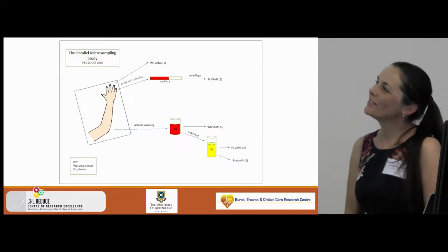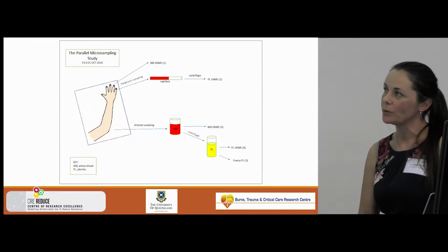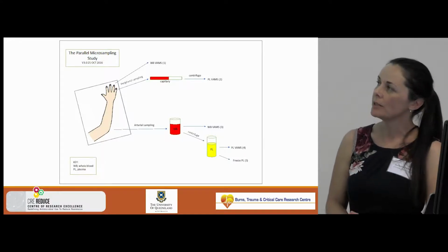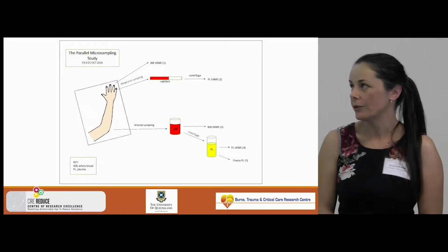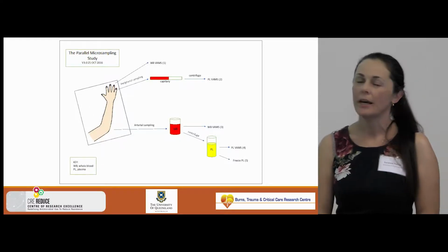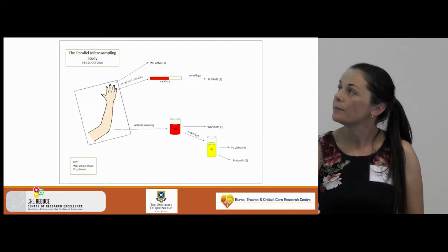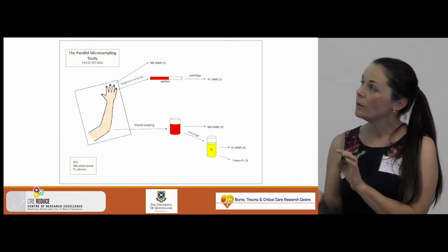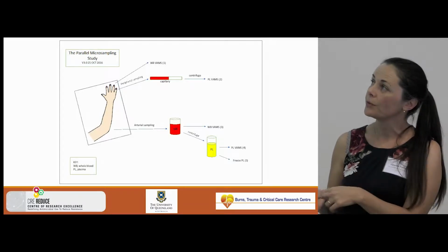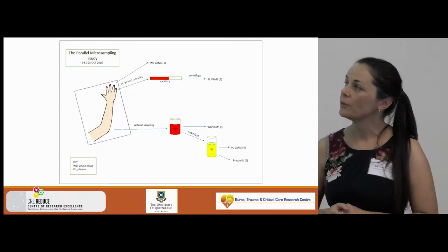Okay, so this is a bit of a description of our adult study that's occurring at the Royal Brisbane Hospital at the moment. Here our patients receive a dose of vancomycin, and then for each time point, we collect 5 different samples. We collect a peripheral sample of whole blood VAMS. We collect a capillary peripheral sample, which we centrifuge and apply the plasma to a VAMS device.